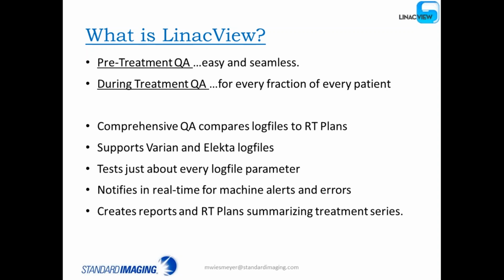You can also do during-treatment QA, and you'll get a flavor of how this works during the presentation. Basically you can do your QA before and QA during, keep track of it on a patient-by-patient, treatment-by-treatment basis, and essentially you have a complete record for every treatment of the finest details of your delivery.